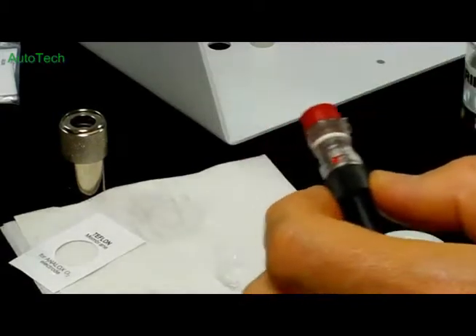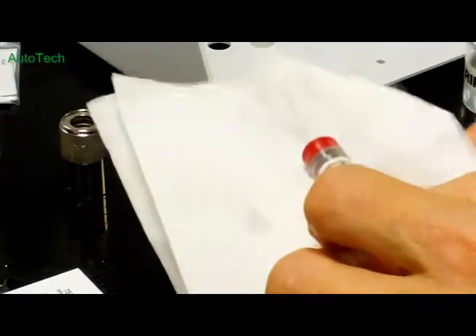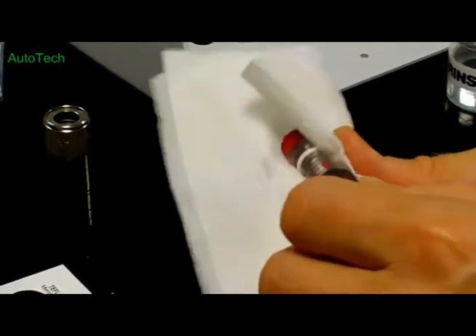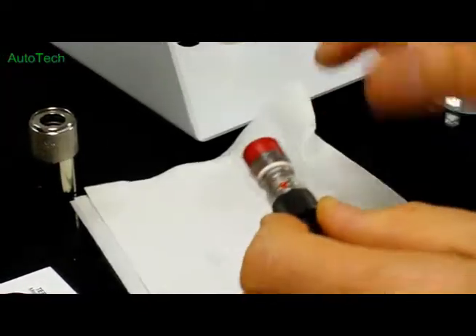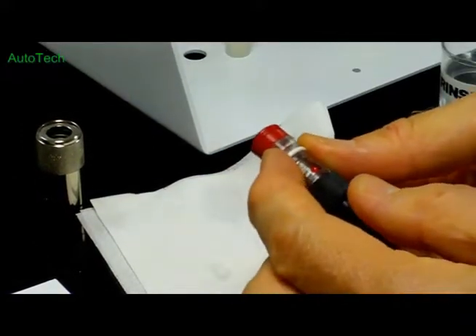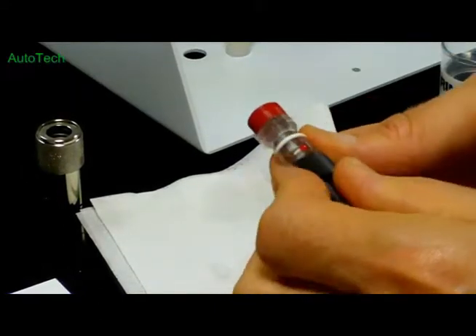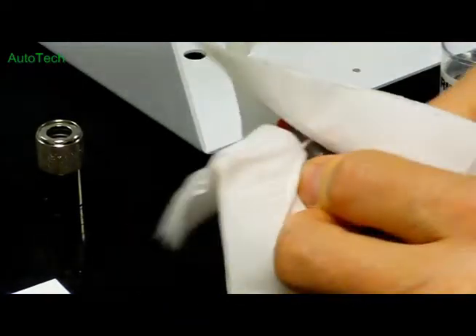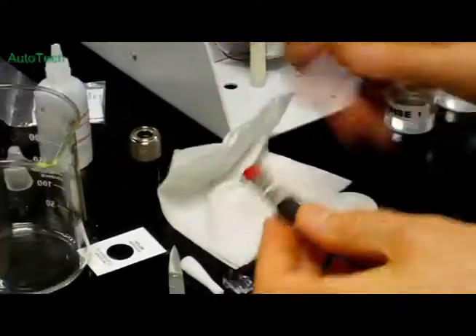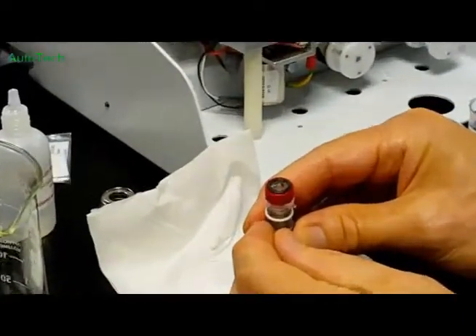And now we're going to just dry the outside of the electrode, removing excess electrolyte. Check once again that the black back nut is firmly tightened up, and then move the O-ring back into the O-ring groove to cover the bleed hole. And again, we're going to just dry it thoroughly. Now we're going to inspect the end of the electrode to make sure we have a nice dome appearance to the membrane.